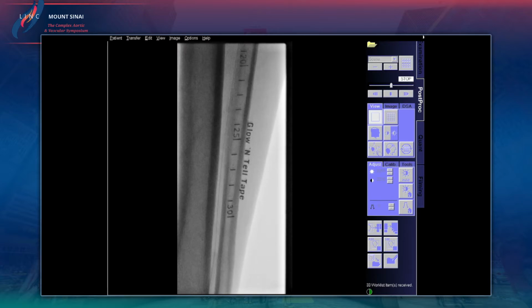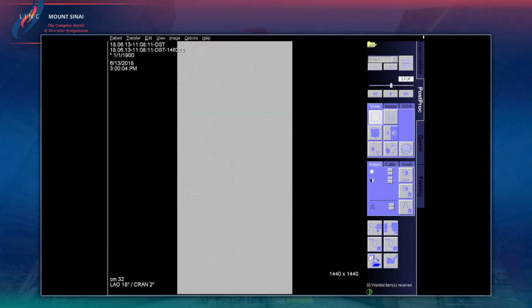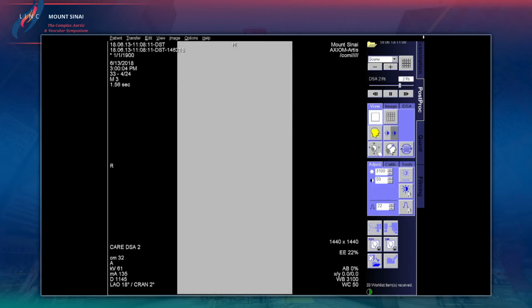My worry here is exactly what I said, is perforation. And to Marianne's point, I think that the embolization is a risk. It's a risk with every type of intervention we do. The atherectomy devices vary in the type of embolization, though, and so the good thing about TurboHawk and SilverHawk is that when you get emboli, they're things that you can see and you can retrieve, as opposed to some of the other devices where you get more smaller diffuse particles. I guess it's a very important point, because we always think all the other devices are safe concerning embolization, but that's not the case. Yeah.